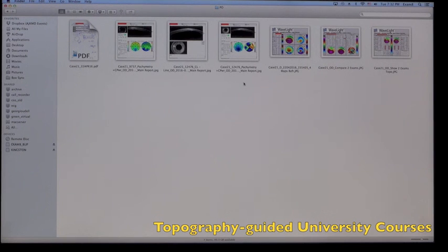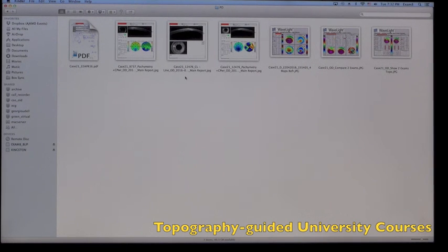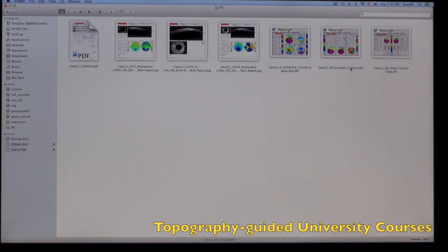A sagittal OCT image to show the depth of cross-linking achieved, and then pentacam, pentacam comparisons, and topometric comparisons.